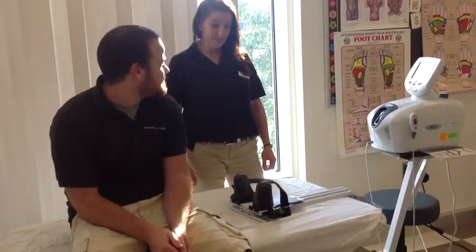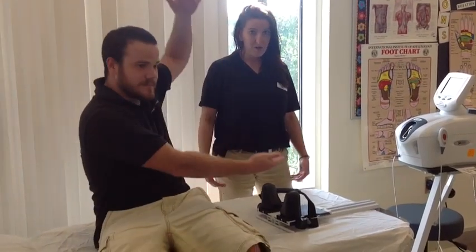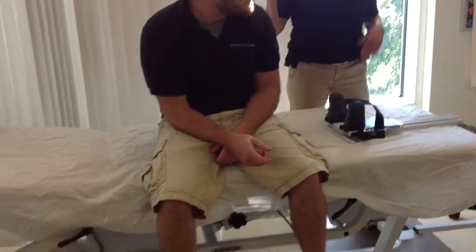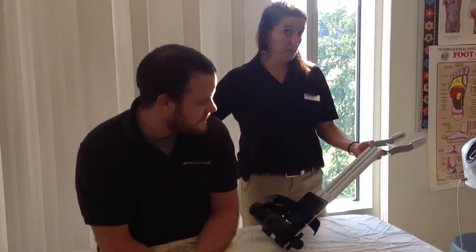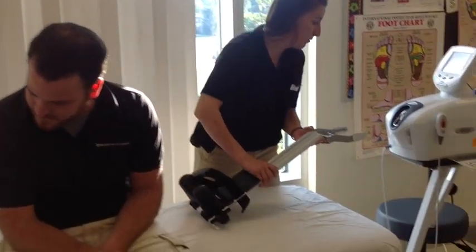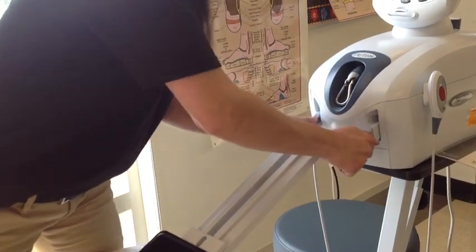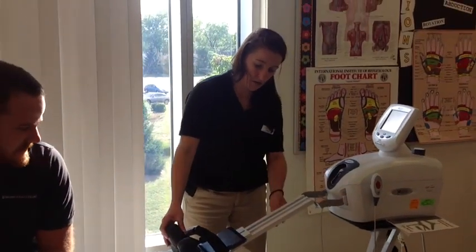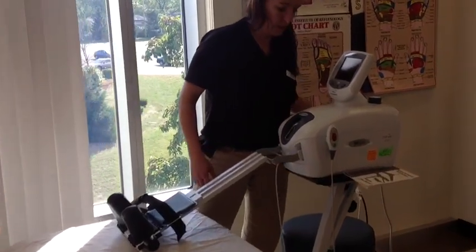This is Craig. We're going to do some cervical traction on Craig. This is a mechanical device for cervical traction, and Teresa is going to show you how to set it up. First, you're going to make sure that you drape your table for every new patient. Then make sure the table is flat, and then attach the traction unit — kind of jam it in there and pull on it to make sure it's secure, making sure that this is at about 25 degrees.